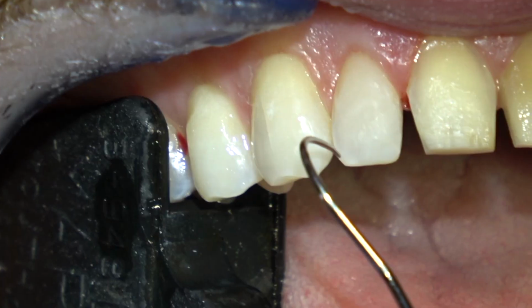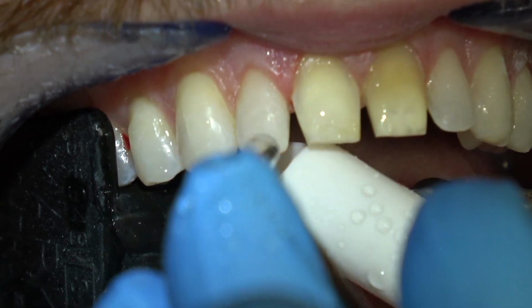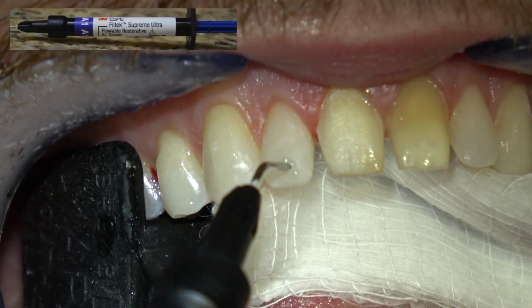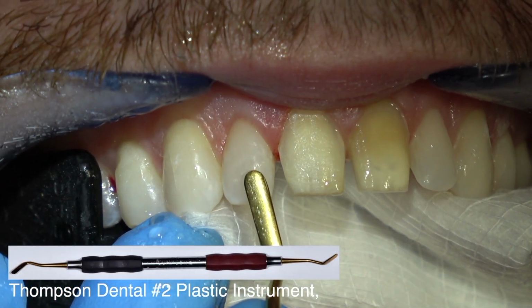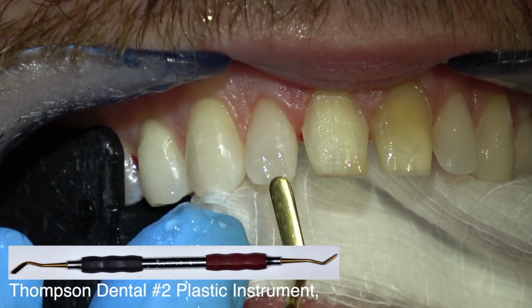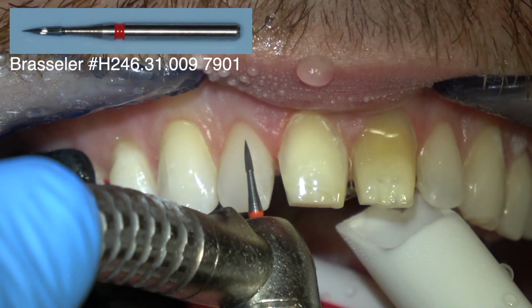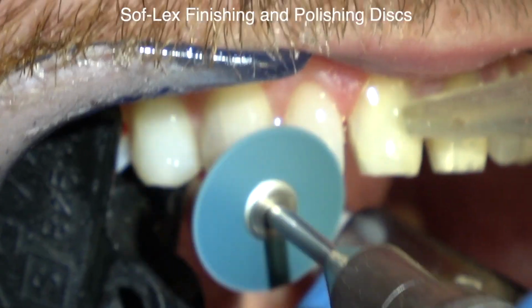Then I'm going to contour again with the polishing disc, and there are two different grits. One's a medium and one's a fine. So begin with the medium and then finish with the fine. And you want it again to move from the composite to the tooth. Okay, so I had another little void, so I opened that just a bit and placed some more composite. You don't have to place primer adhesive if you're repairing a void or adding to existing composite.